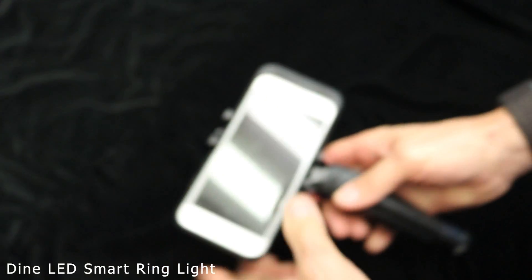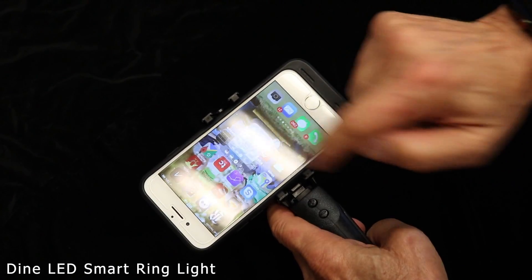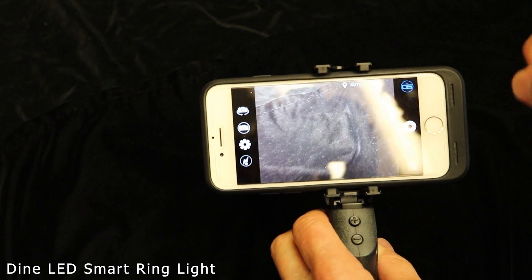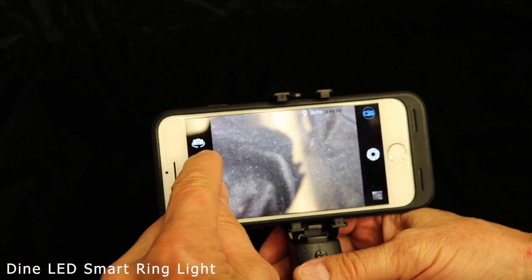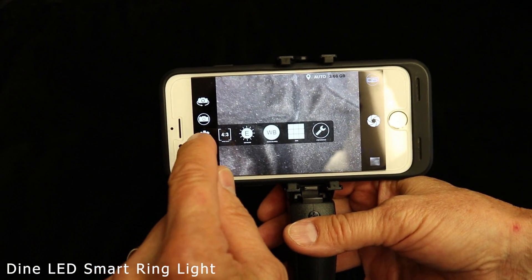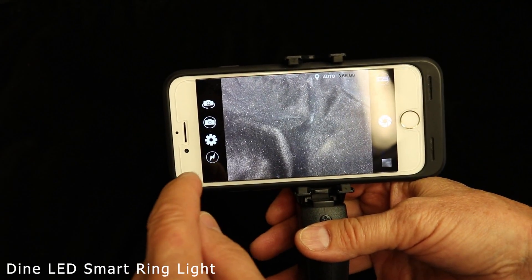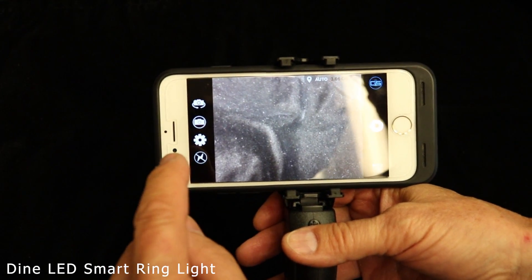It's really a simple point-and-shoot device. You put your phone in here, turn your phone on, and go to the Grip and Shoot app. Once that comes up, it wants you to press the button, and when you press the button, that activates the communication. We have a lot of settings: you can flip the camera forward or backward, choose still picture, video, or slow motion video, and then you have settings for 4:3, 16:9, different flash settings, grids, white balance, macro, and one-to-one. You can use the flash on your phone instead of the ring light, depending on how you want to do that.